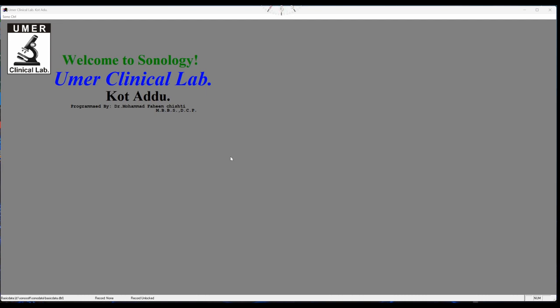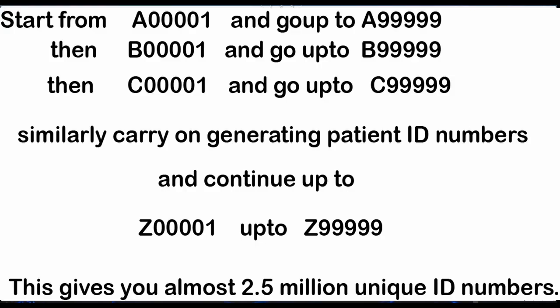When a patient comes to your clinic, the receptionist should have a register on the table. He should write down the name of the patient and also write down the unique ID number. This unique ID number should start with an English alphabet letter and then digits. The alphabet should be A, B, C, D, E, F. I recommend that you start from A and then the digits should be 00001.